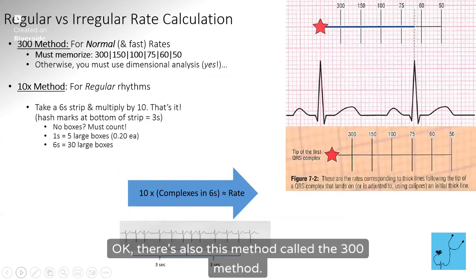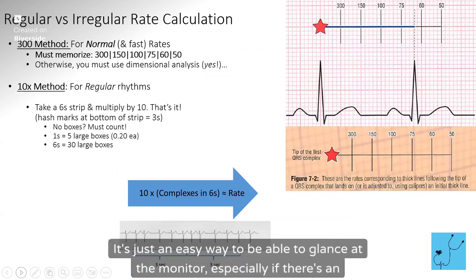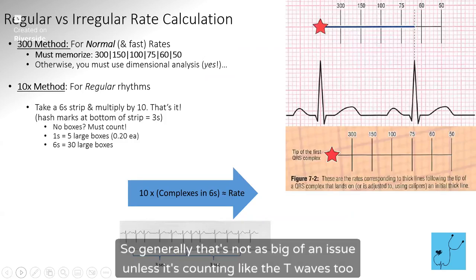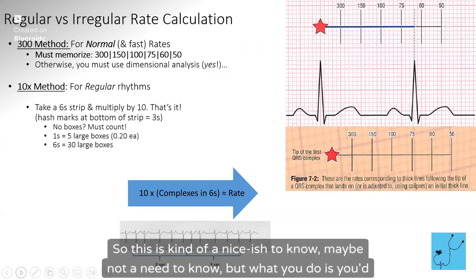Okay, there's also this method called the 300 method. It's really just to guesstimate rate. It's an easy way to glance at the monitor, especially if there's an emergency, and see how fast or how slow the heart might be going without having to count. Now we have monitors with numbers, so generally that's not as big of an issue unless it's counting the T waves too many times or double counting or something like that.